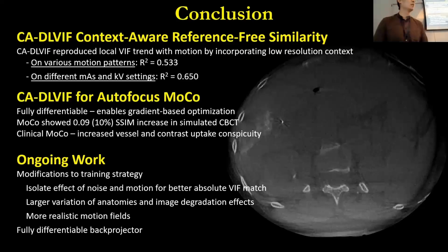I have one for you. Yep. You're looking for a fully differentiable back projector, but actually respiratory motion is not differentiable. You have sliding along the rib cage and the spine. Would that be a problem in real data? Oh, you mean the motion happening in real data may not be fully differentiable? Yeah. In the pleura, you have sliding.